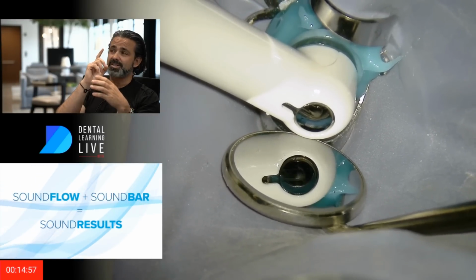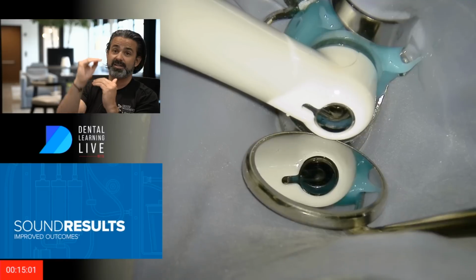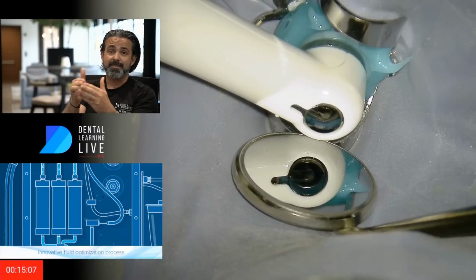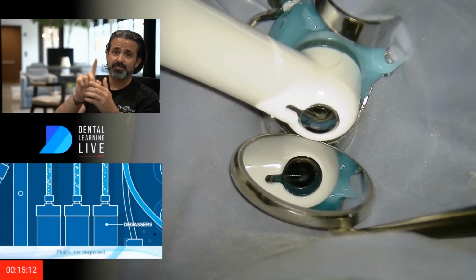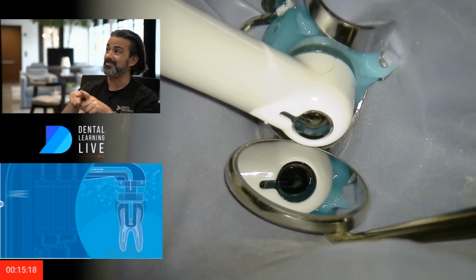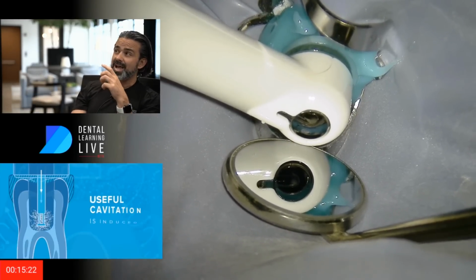If you can imagine in your mind's eye, if you can keep it right parallel with the orifice, right above it, just in line with it, it just seems to work really well. If I'm off axis, the dancing bubble will stream and bounce a little bit. In my mind, I'm trying to maximize the fluid dynamics to work to my advantage, especially when I'm dealing with a fork in the road.